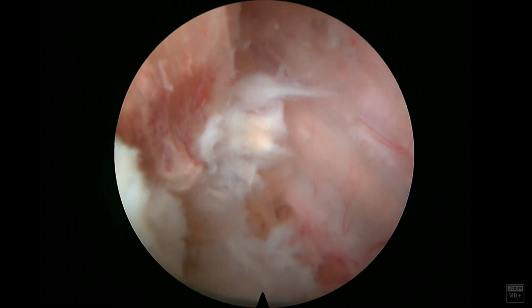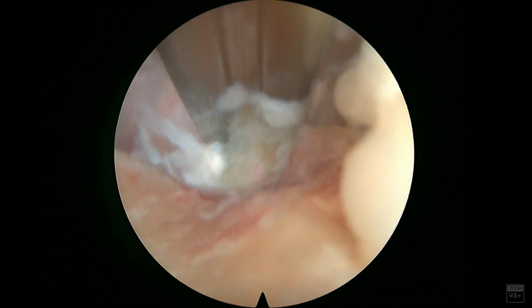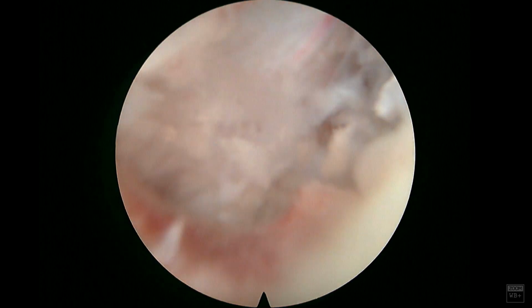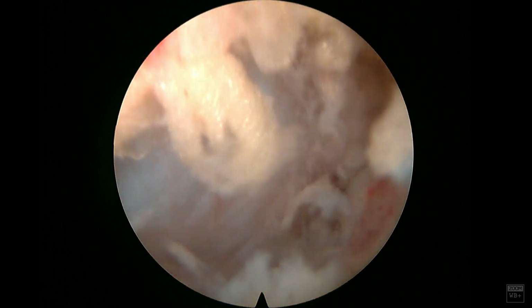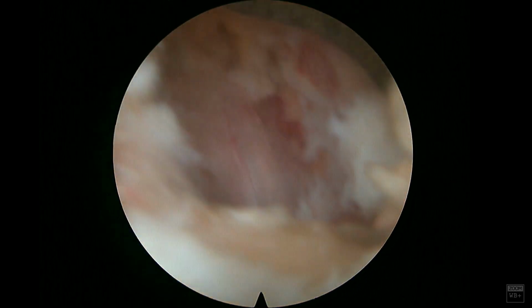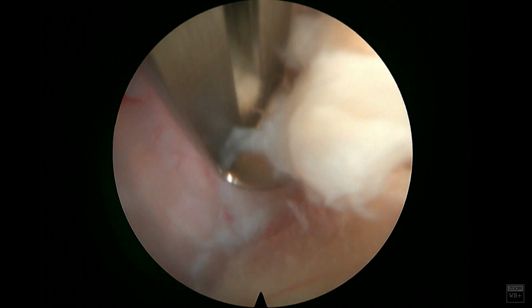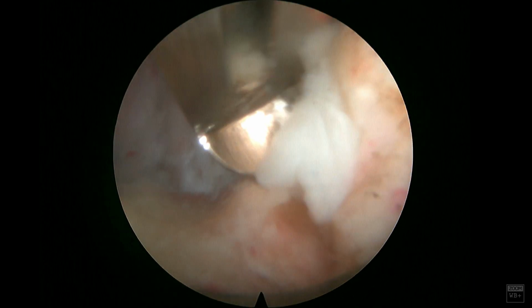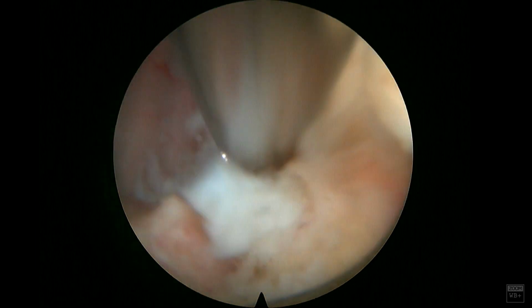I want to make sure that I'm really checking all the anatomical considerations of this decompression. Again, we're really only working within an 8 to 9, maybe 10 millimeter area here, and a lot is going on in this area. You want to make sure that you're not decompressing somewhere where you shouldn't, or obviously decompressing too much. That's why I'm not extending my bony decompression up dorsally, eventually maybe, but more laterally. This will help stabilize that segment and not take too much joint. You can see here this capsule is a little bit redundant, so I'm trying to remove a little bit of that as well.